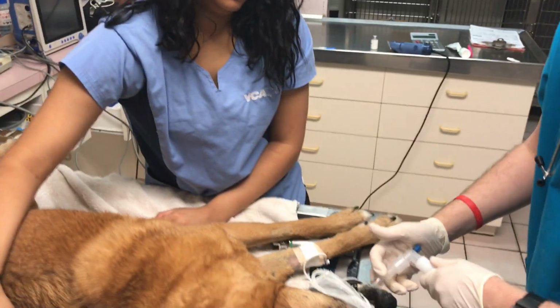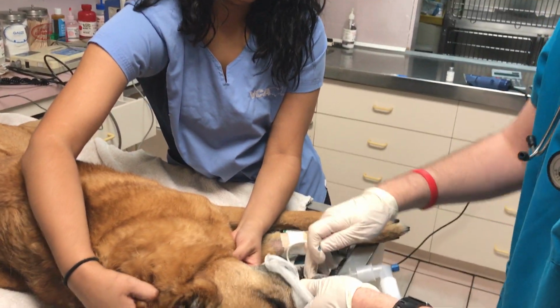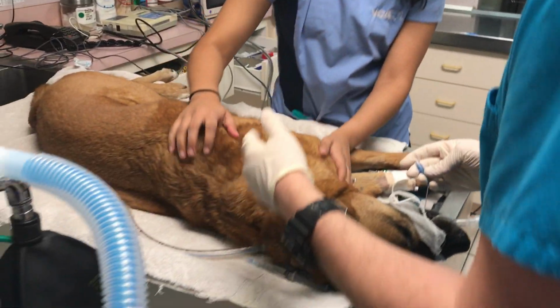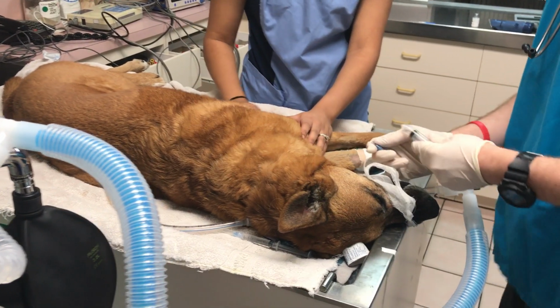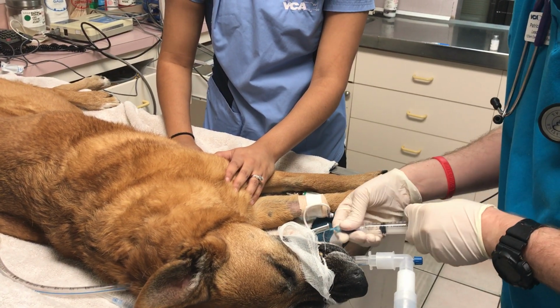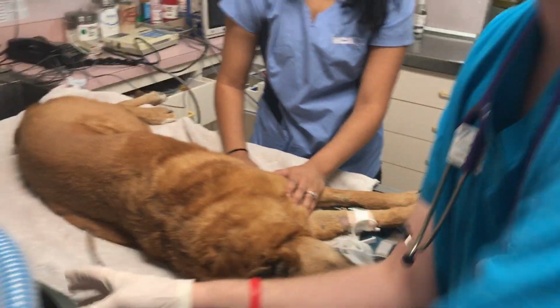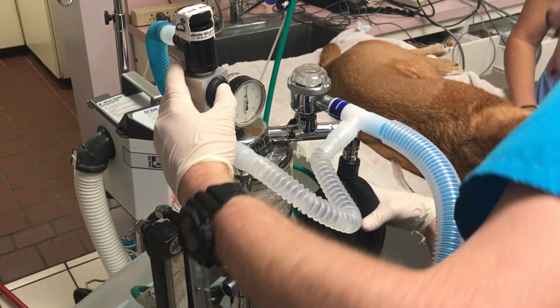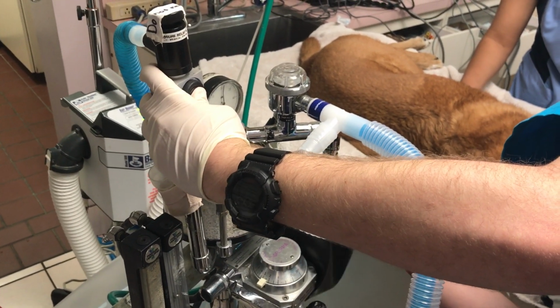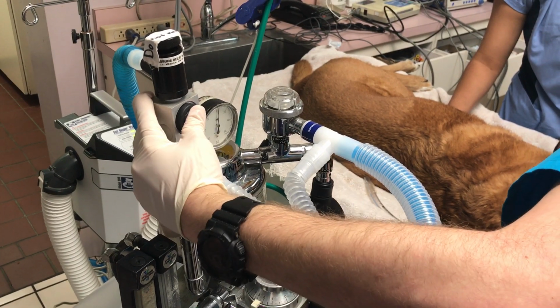Now, you don't want to just inflate the cuff. What you'll do is inflate a little bit at a time, and then what you want is kind of a soft pillow feel to start with. And then what you next want to do is hold off and give a breath, and you want to listen for a leak. I didn't hear any gas leaking, so the cuff's in place.